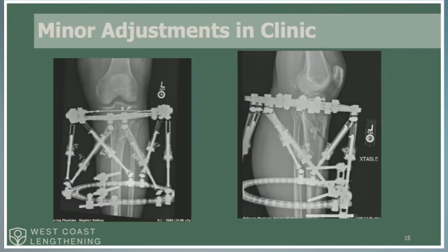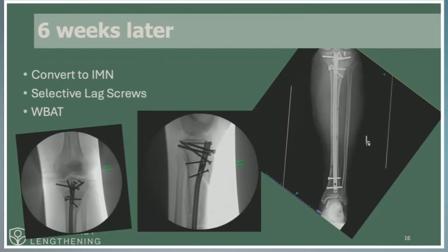Could we have left this on for 3-4 months and potentially let the bone heal? Yes, but after 6 weeks, we converted into internal fixation.